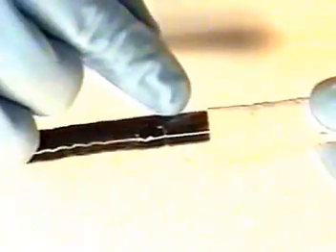For added protection, you can use ordinary paper towel by wrapping it around the insertion tube below the tape and the glue line, and taping this onto the insertion tube. This will also protect the insertion tube from any glue that might spill out onto the insertion tube.